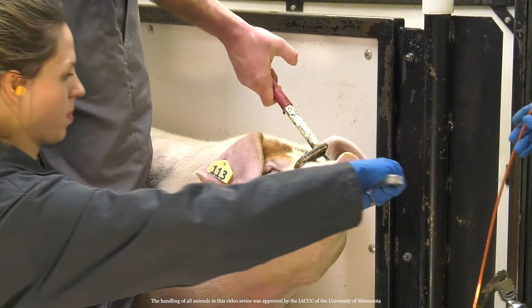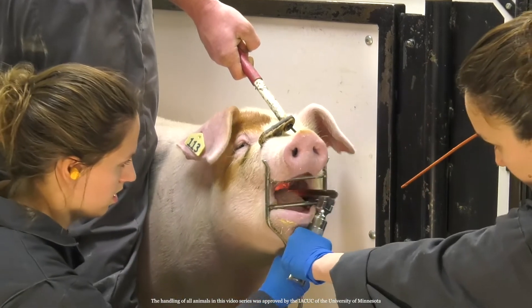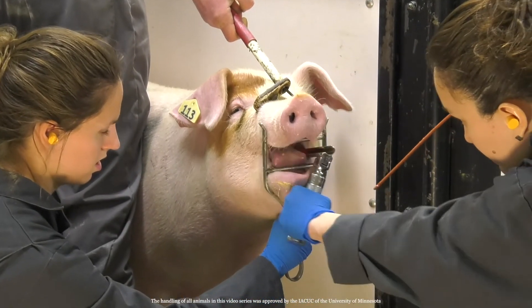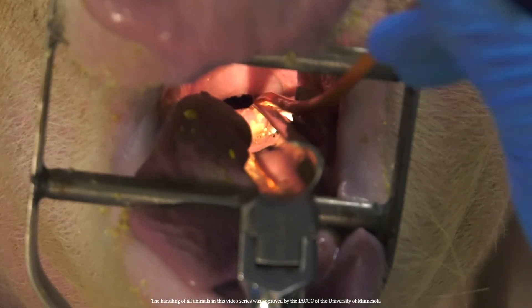Use the blade of the laryngoscope to see into the back of the pig's throat. If you don't have a laryngoscope, position the pig under a light source and use a tongue depressor. Next, use your other hand to slowly feed the catheter into the pig's throat.